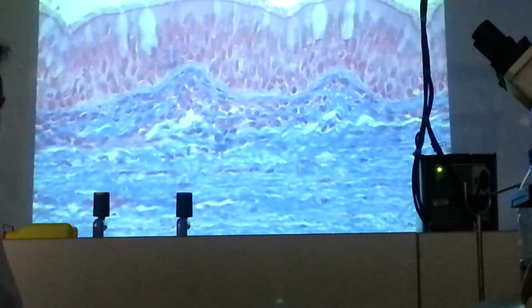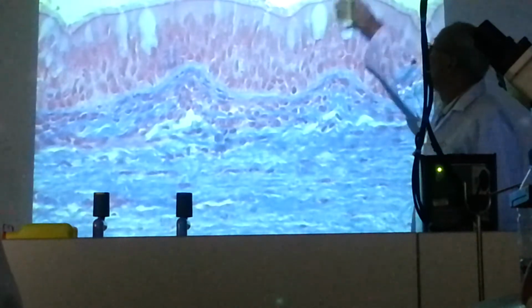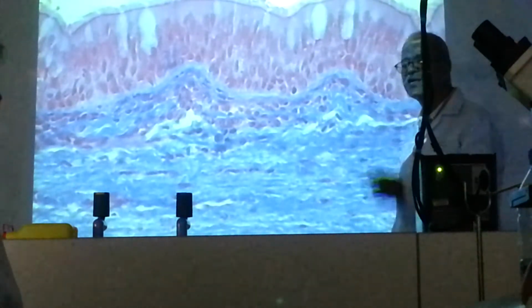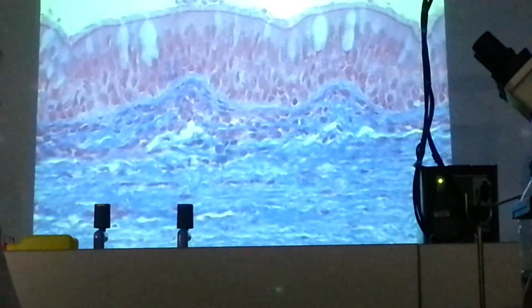Now, columnar cells with basal oval nuclei, goblet cells with upper distended part, cells reaching the surface are provided with cilia. Select 2 from these 3 points. Yes, from these 3 points. Now, by the way, so as not to break the slide again.